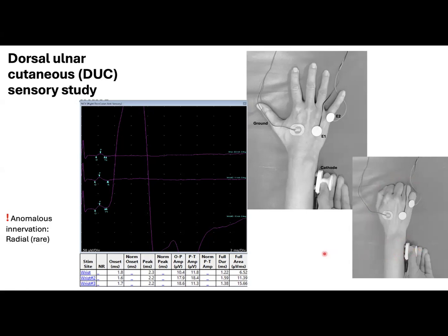In the first tracing, we have the DUC SNAP, again with insufficient stimulation resulting in low amplitudes at 10.4 microvolts and prolonged latencies. In the bottom tracings, we can see good amplitudes and conduction velocities. However, when we increase the stimulation a bit more, we got this big motor artifact.